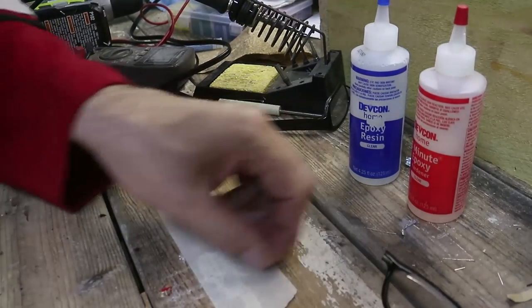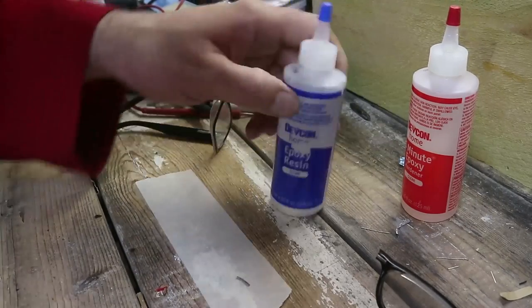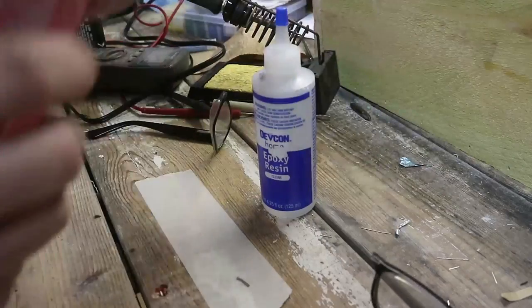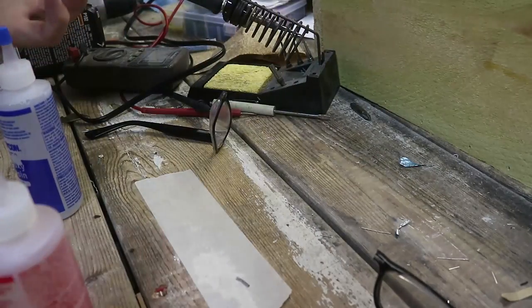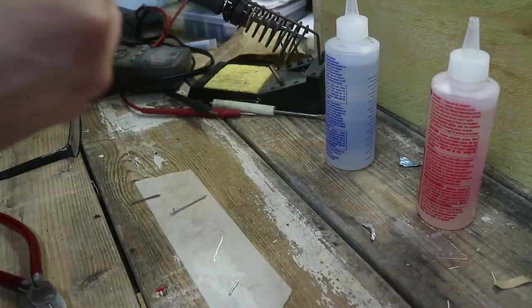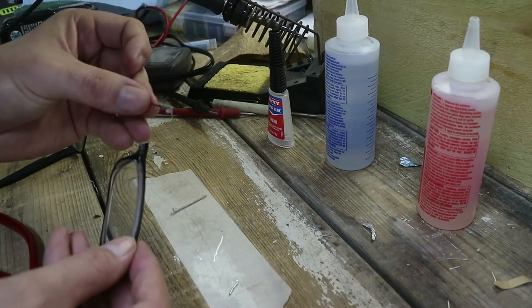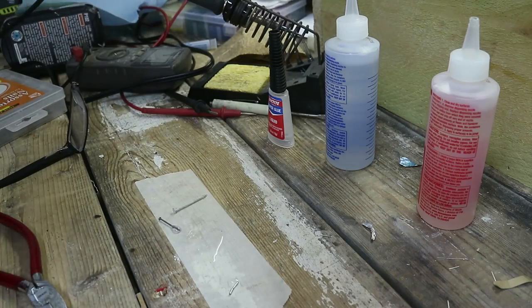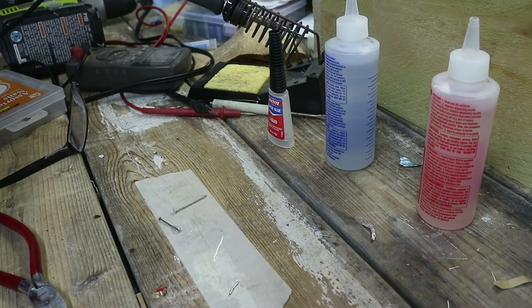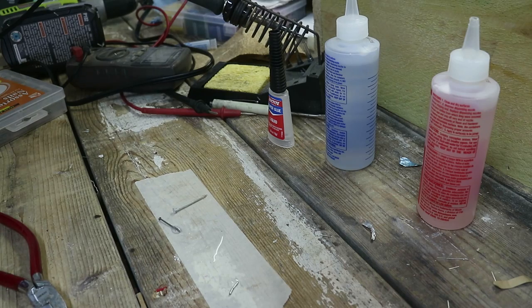I got a little bend in it now, so hopefully I can get better alignment, and I'm gonna try some 5-minute epoxy, and I'm just gonna try to hold it together by hand. I don't really know how else to do this. So I'm just gonna cake epoxy on here, and let's see what I can do. Try not to make a huge mess around the outside, because I can't really clean that up easily where my nose goes, and I don't want it to hurt, you know. I don't really care what they look like.